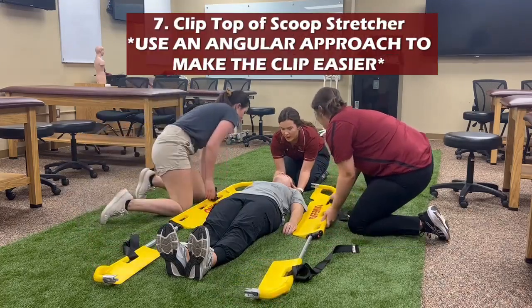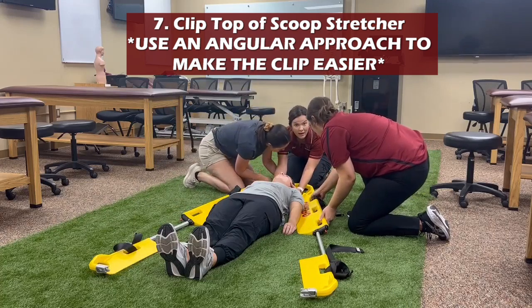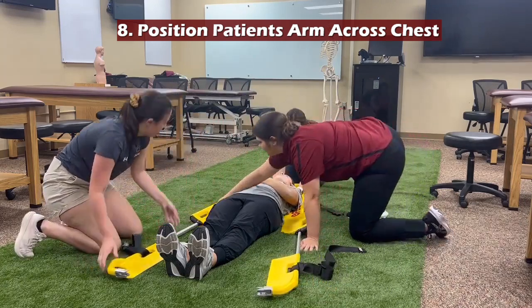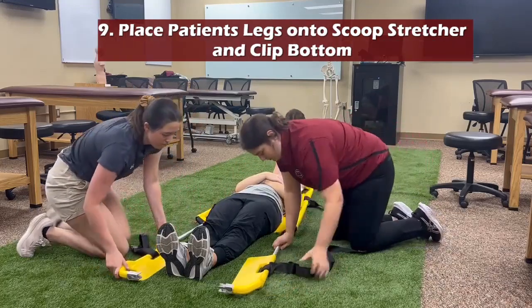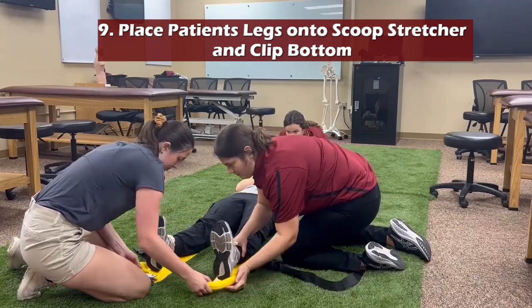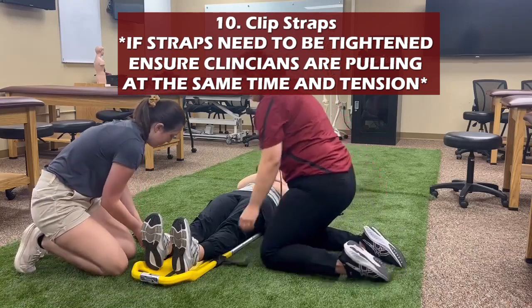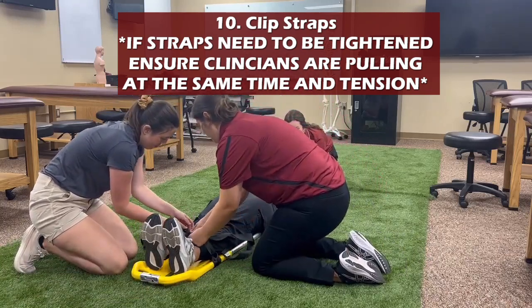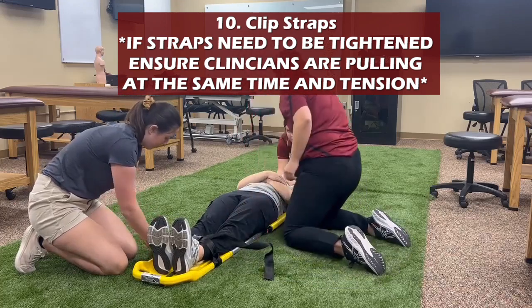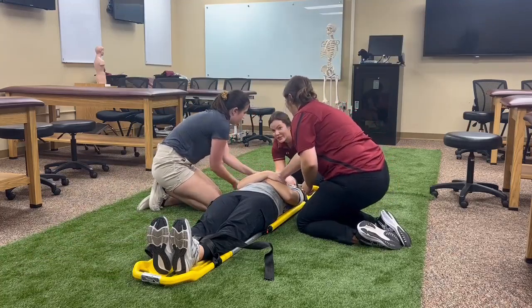So what you'll do is you'll come in at an angle and scoop to clip the top, maintaining inline stabilization the whole time. So maneuver her arms across her chest. And clip at the bottom. Then you'll tighten the straps from the feet up. And you're done.